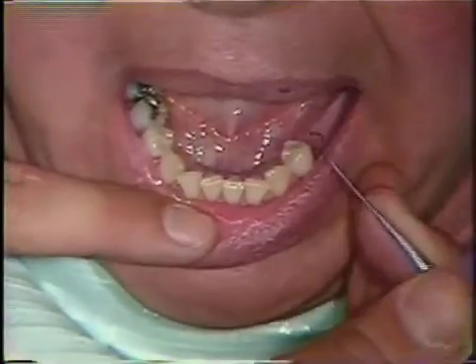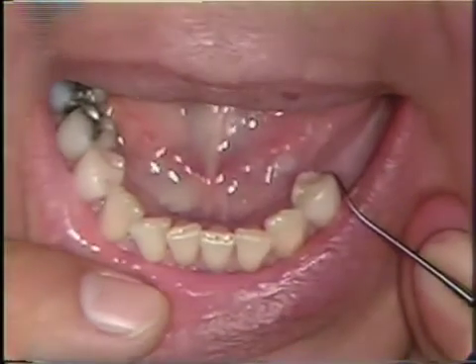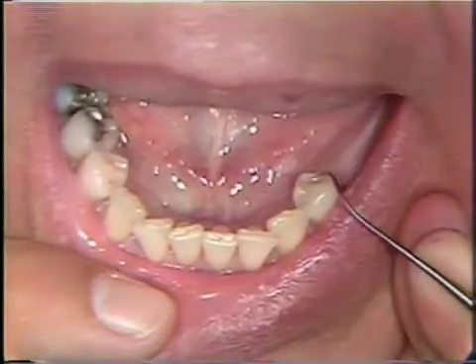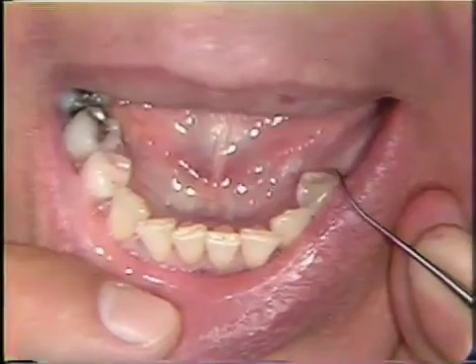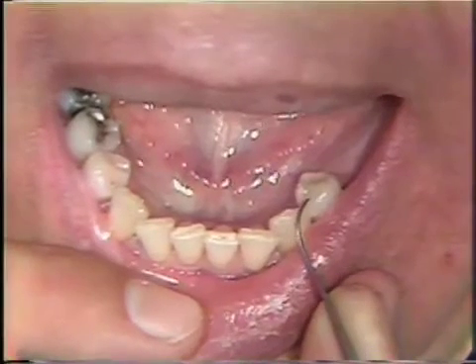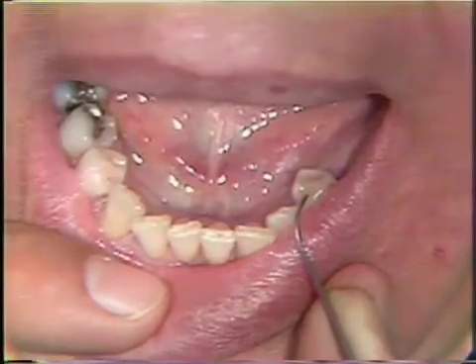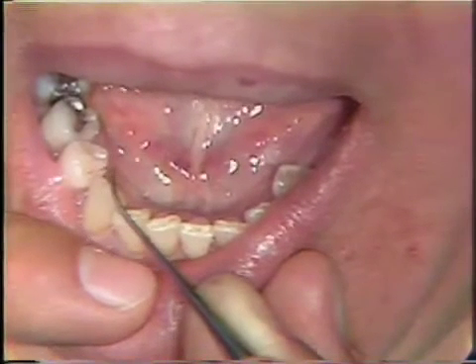The three rests are now completed. We have on the distal of the bicuspid the primary occlusal rest, which is probably the largest of the three, because it is going to dissipate the force from the partial to the tooth and we want to prevent fracture of that rest. So it is a little bit larger possibly than our indirect retainer rests. The two indirect retainer rests are on the mesial of the bicuspid on that same side and on the mesial of the bicuspid of the opposite side.